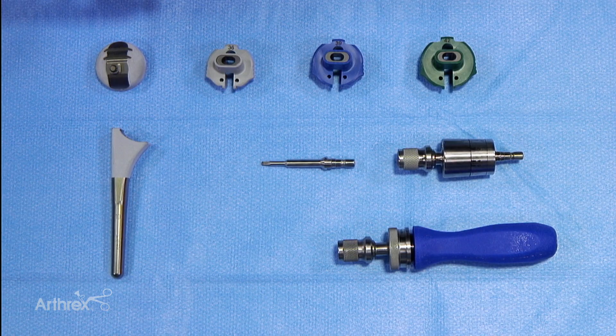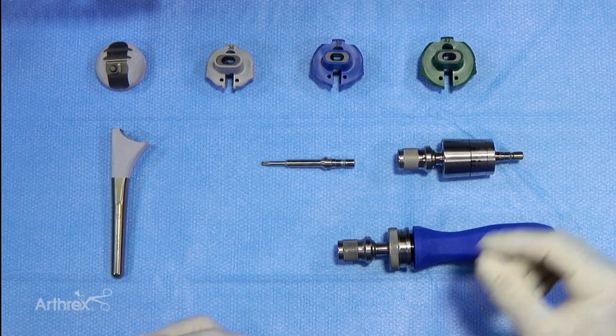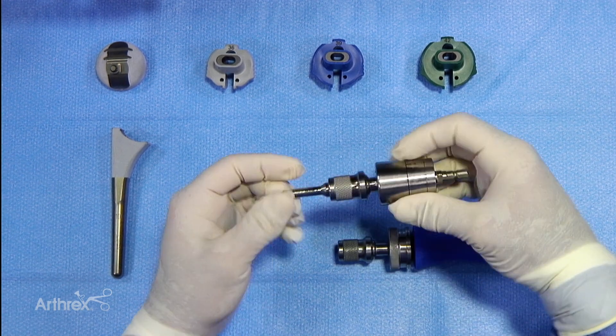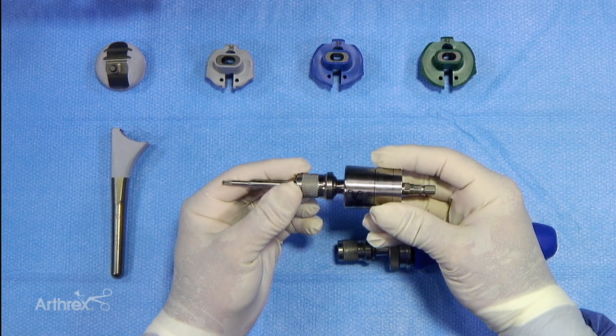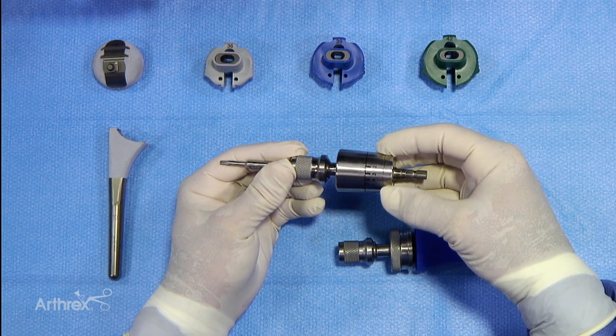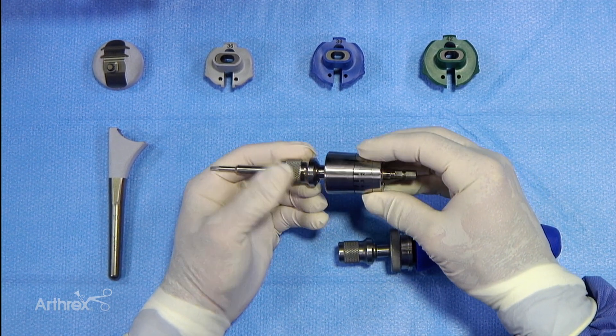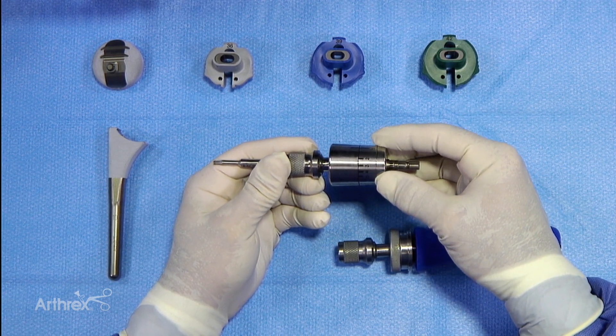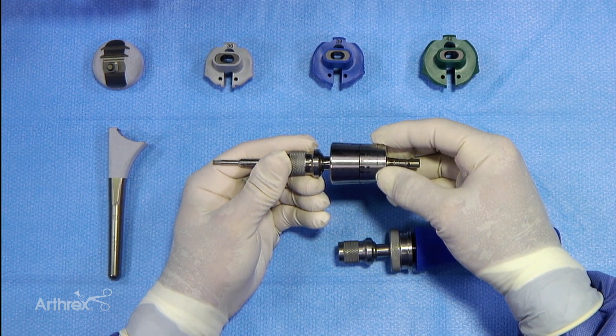Now we're ready to put our cup into our stem and fix that properly. In preparation for that, we'll go ahead and put our screwdriver together with a quick couple that you see here. You also see that it has the torque measurements on the torque limiting section of this device, and our plan is not to exceed 5 Newton meters of force.